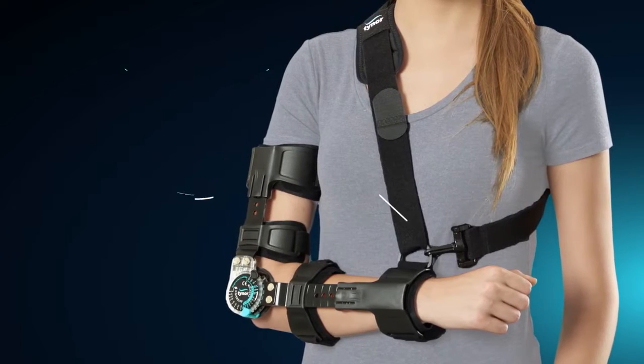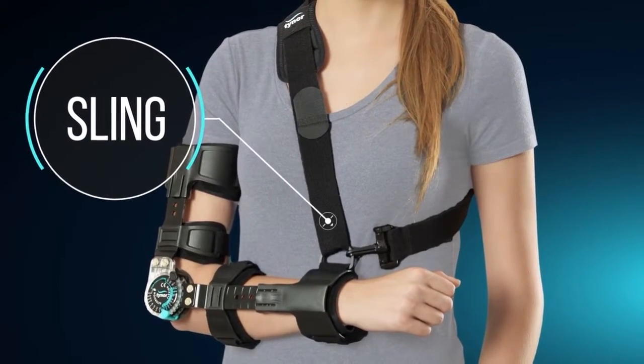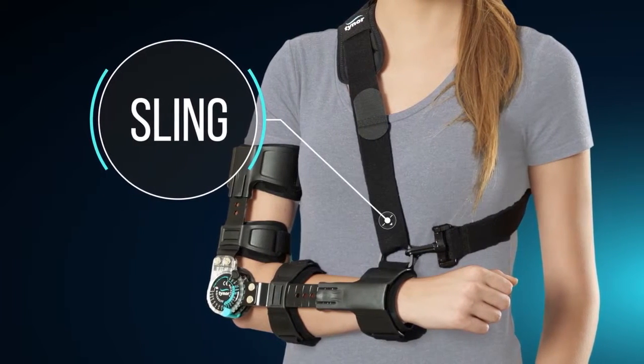In the design, we have integrated a sling that is completely removable depending on the usage. This sling prevents fatigue of the shoulder muscles at an immobilizing angle.